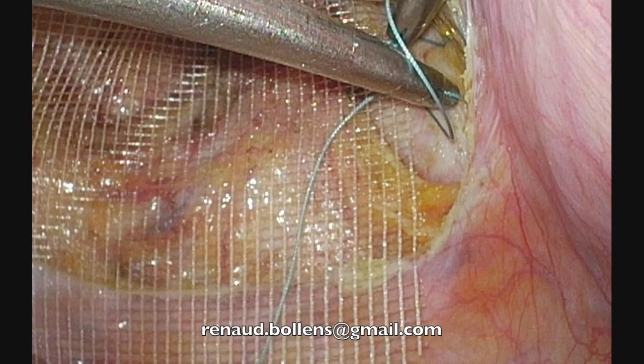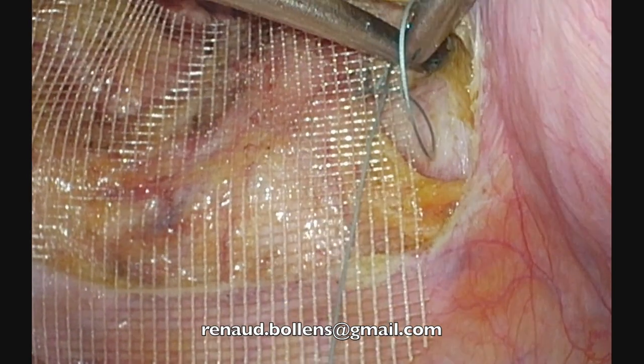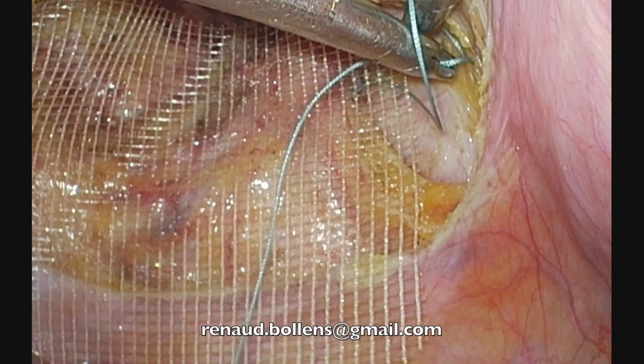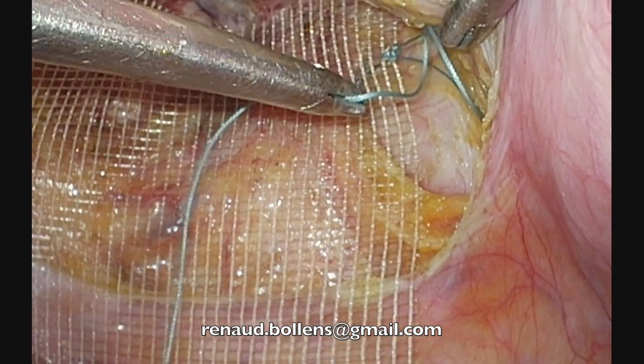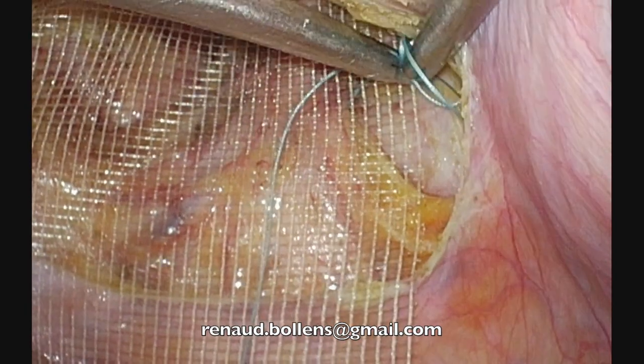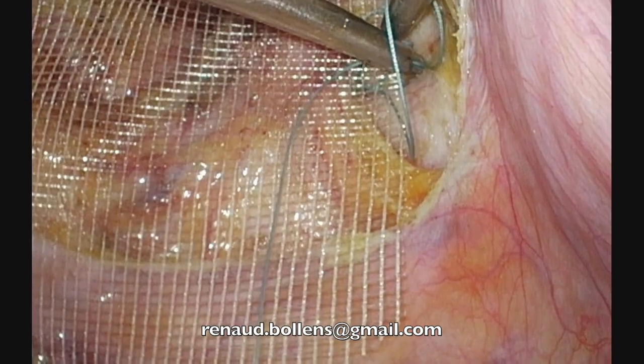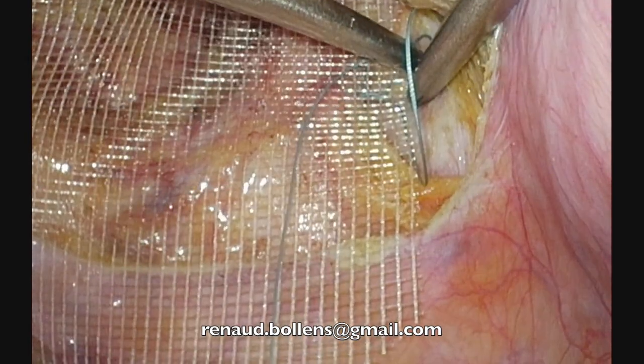I slide my left hand close to the fixed point, and I jump over. If you don't do like that, to pass outside you will pull tension on the short thread to come out, but you put tension on the first one, on the fixed point. Then the idea to avoid that is at this level, you slide close to the fixed point, you jump over, and then you tighten.